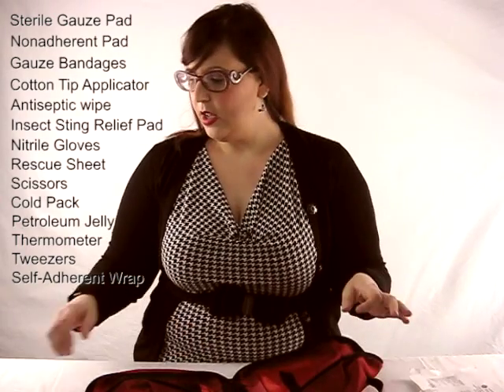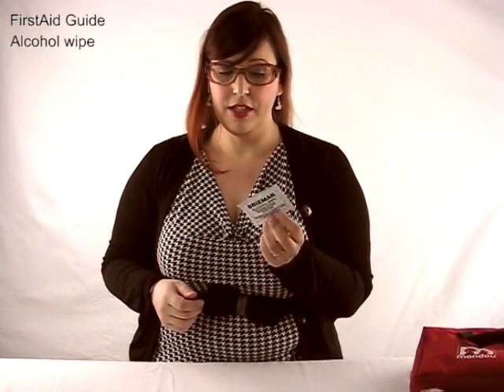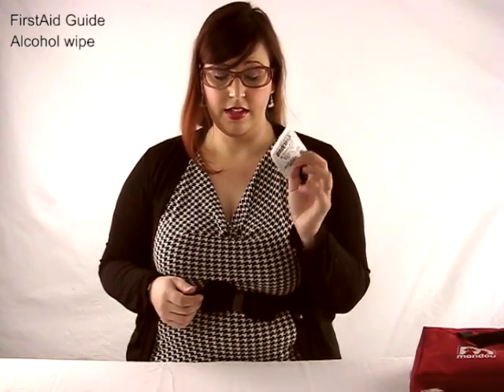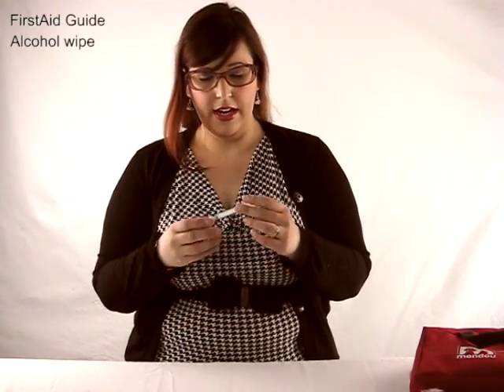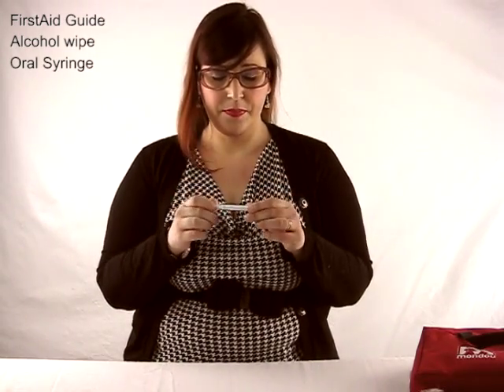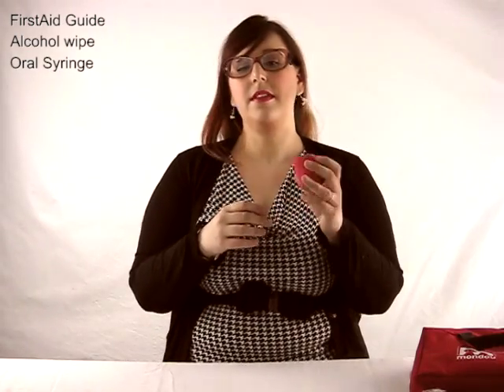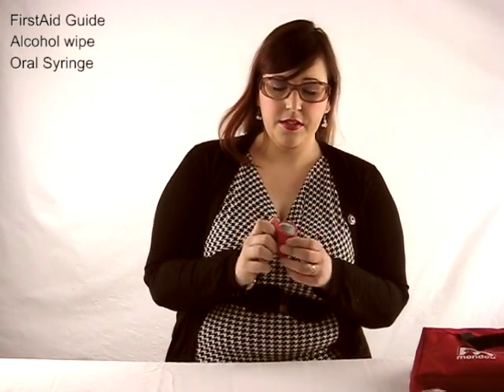What I have added to this first aid kit is very important: a guide on what to do with first aid — some things you'll know, some things you won't, so it's always good to have handy. There are also alcohol wipes specifically to clean your instruments, not to put on your pet. You don't want to put them on a gash or anything like that — they're really just for tools. I've also got a syringe for administering oral liquid medication.